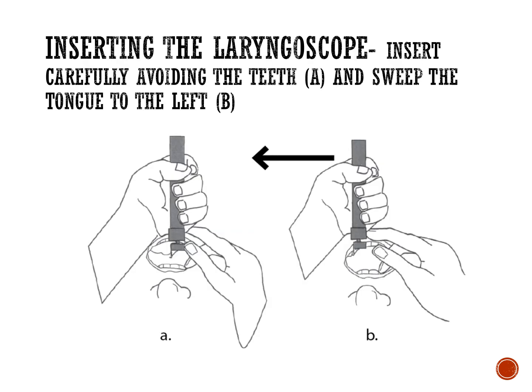Now, again, back to basics here, for any patient, whether they be a difficult intubation or not, inserting the laryngoscope on the right-hand side, under the tongue, because the patient's kind of upside down, if you will.